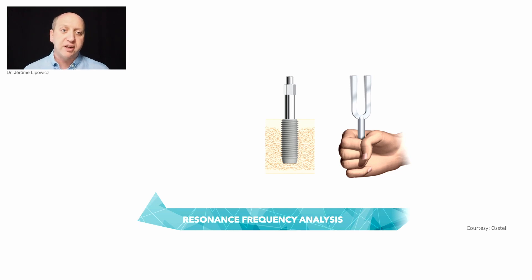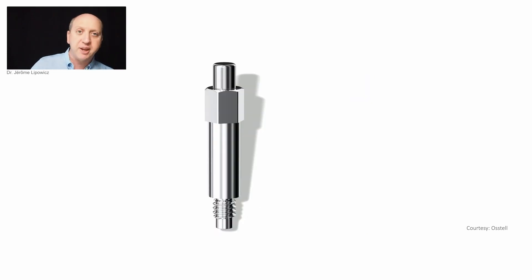It is a magnetic pulse that will induce a vibration on a transducer, which is a rod called the SmartPeg. And those SmartPeg, they are single-use instruments I can show you. They are served sterile in their package.